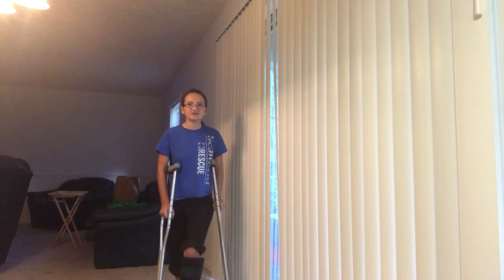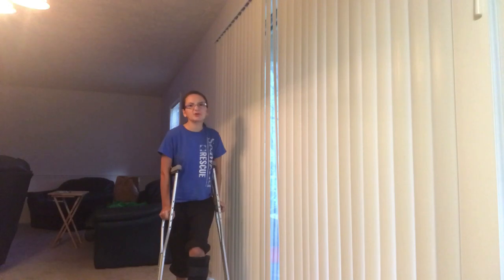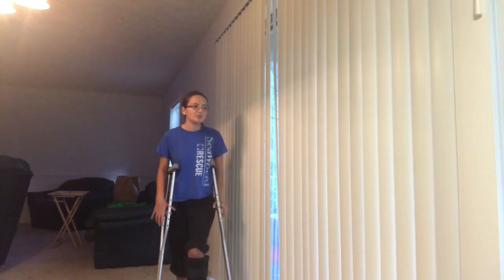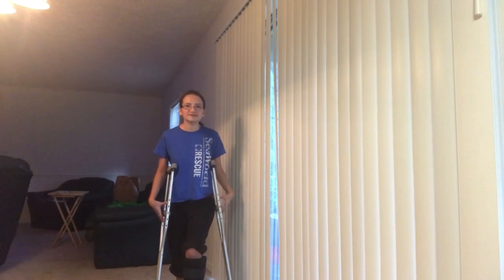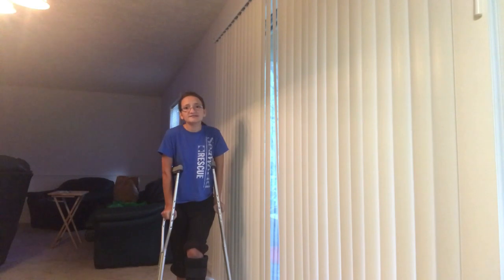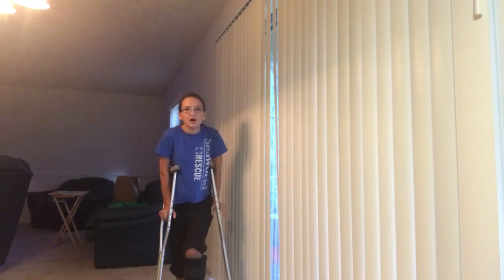So as you can see, my crutches don't even go to my armpits. They could go up a little bit higher. They say they can be about 2 inches below your armpits, but don't use your armpits to take the weight. Use your forearms to take the weight. And let me tell you guys, it's going to get sore. The first week or so, my arms were killing me because they weren't used to me using them to take my full body weight to walk.